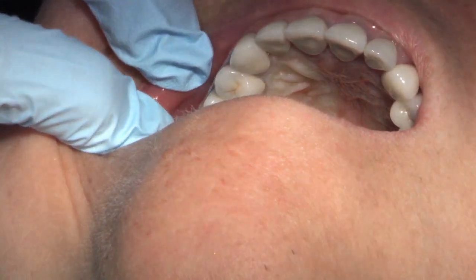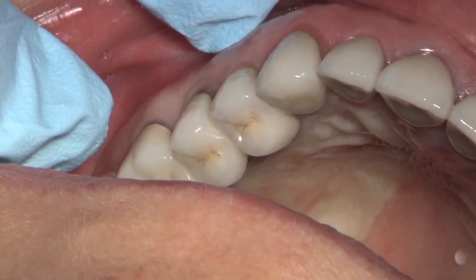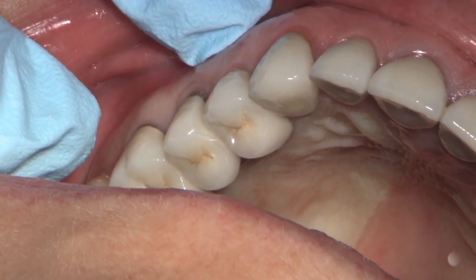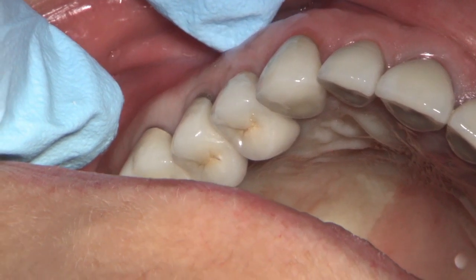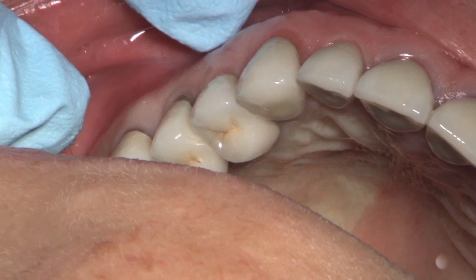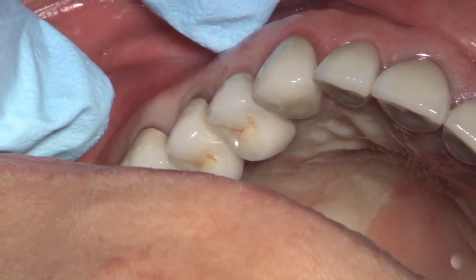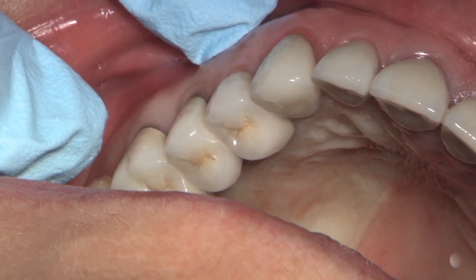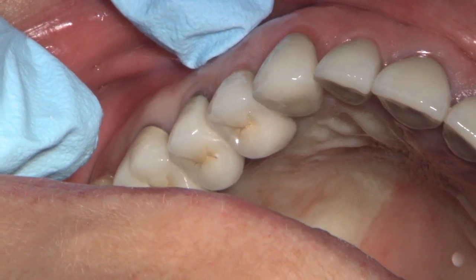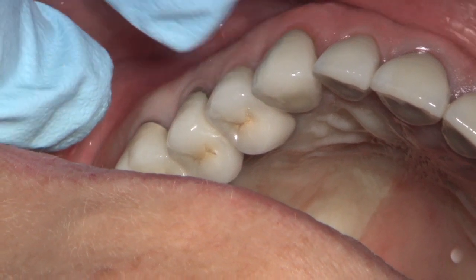You can see the blanching from the mesial of her second molar through to her first bicuspid — look at that. That's as textbook as this gets. From this view you can see right in the palate at the median suture — you can literally see exactly where that stops and it goes back to the second molar.